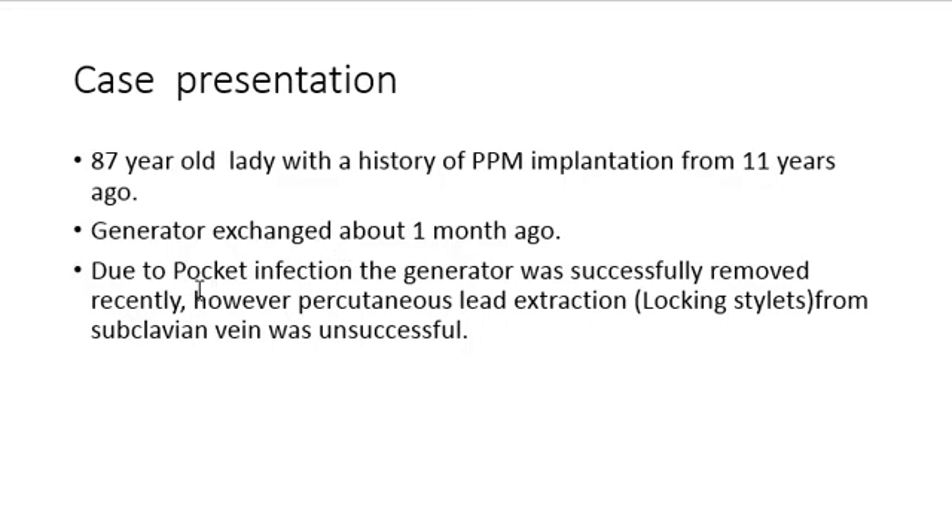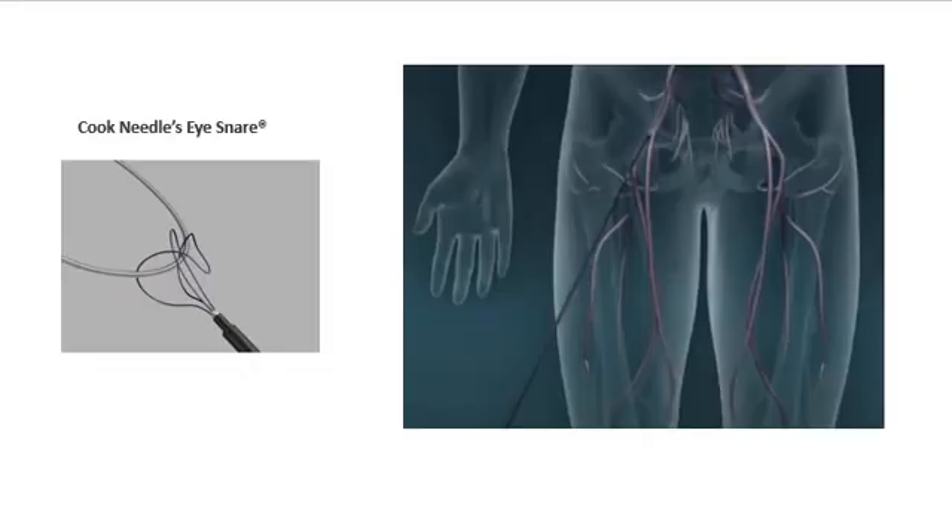She had a generator exchange about one month ago, and due to pocket infection the generator was successfully removed recently. However, percutaneous lead extraction using a locking stylus from the subclavian vein was unsuccessful. There is a special tool called a needle eye snare to grab and extract leads from a femoral approach.